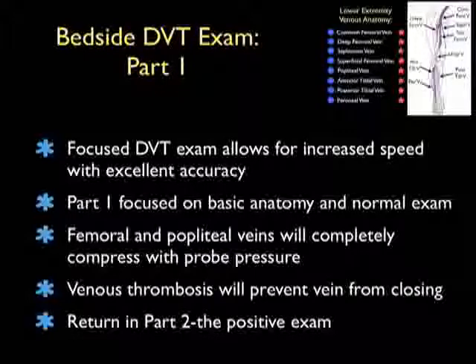Unfortunately, a venous thrombosis will prevent the vein from closing, and so we'll return in Part 2 going over the positive examination and those findings that you might encounter on the focused bedside DVT examination.